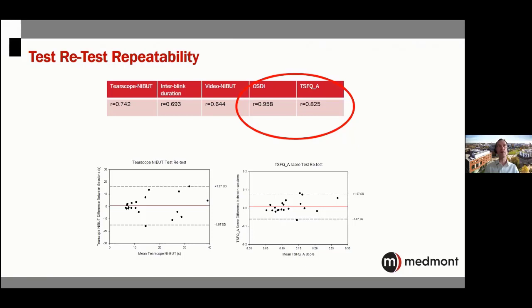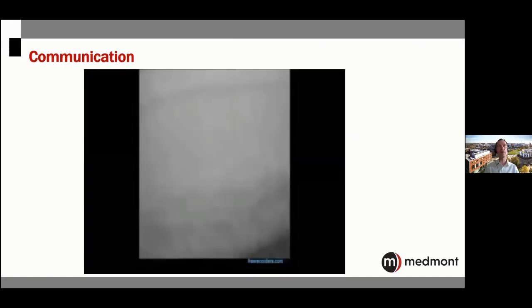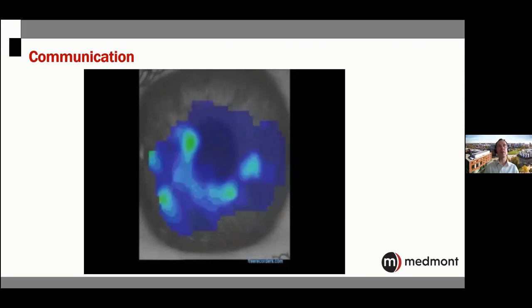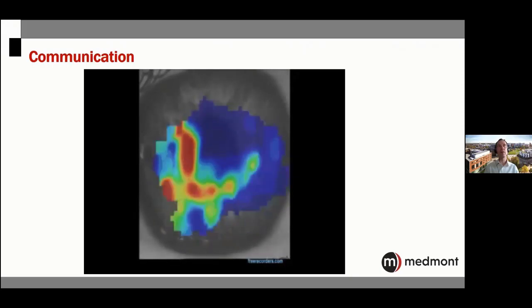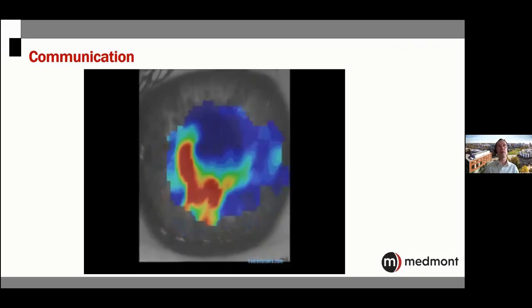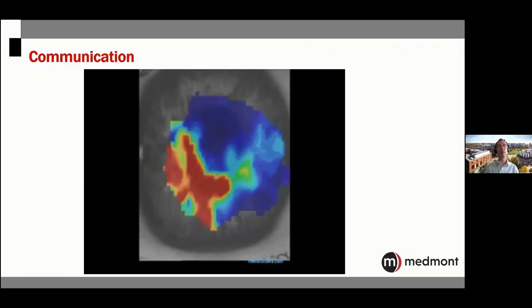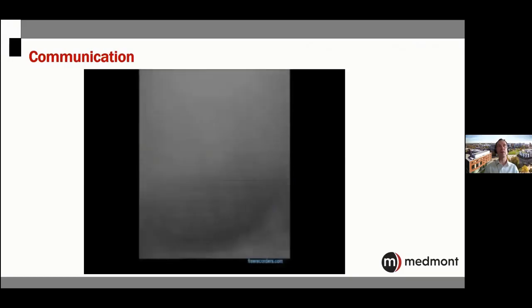The other thing that was really important about this is communication with our patients. When we're showing them a video like this and they're seeing their tear film break up, it helps them to really understand what we've been saying to them and to take that message forward. We know a lot of patients struggle to remember things that we've told them in a consultation. This is a really powerful communication tool.